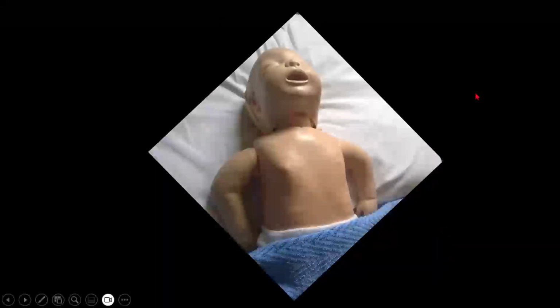Nice. So whenever we start doing the views, it is always good and easy to imagine a clock in front of the baby. Head end is 12 o'clock. Left shoulder, left side is 3 o'clock. Right shoulder, right side is 9 o'clock. And the foot side is 6 o'clock. So henceforth, in whatever video I show you, I will say where I am going to keep the probe marker and the direction of the probe marker in terms of o'clock, so that it is easy for you to understand and it maintains uniformity.